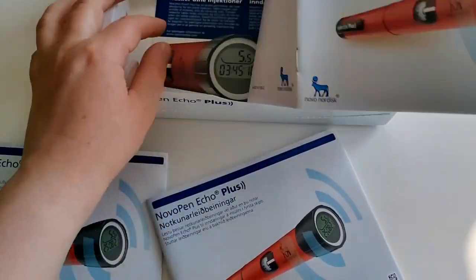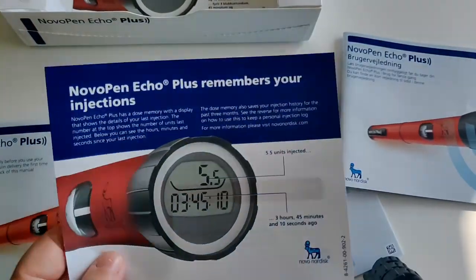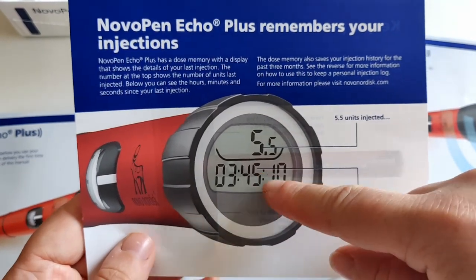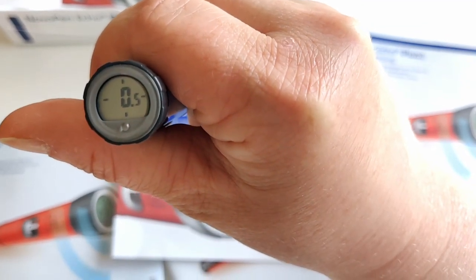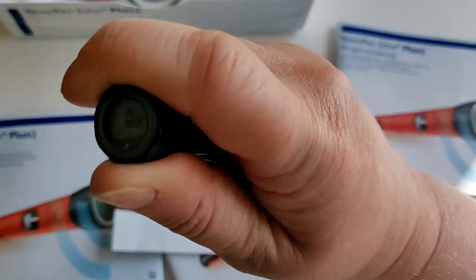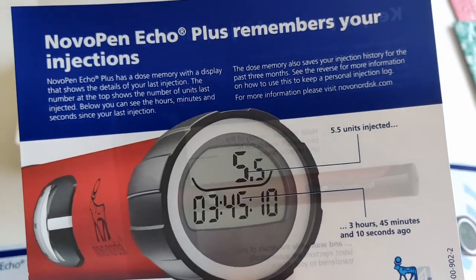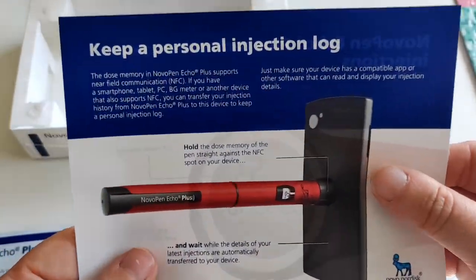I'm looking at the guide — it looks like the same things in different languages. Novo Pen Echo Plus 'remembers your injections.' It has a dose memory display that shows the details of your last injection: the top is the number of units last injected, and below you can see hours, minutes, and seconds. On my previous pen you have these four up/down/left/right bars like a clock — two bars between 12 and 3 would mean it's been two hours since your last injection, which is hard to navigate. This new display is so much better — actual time and date with hours, minutes, seconds.